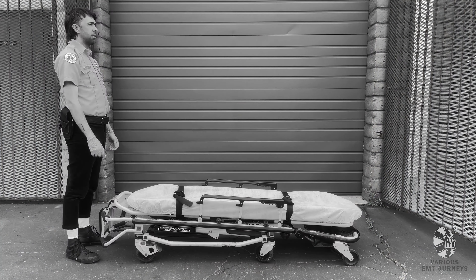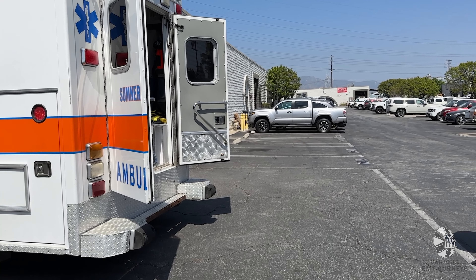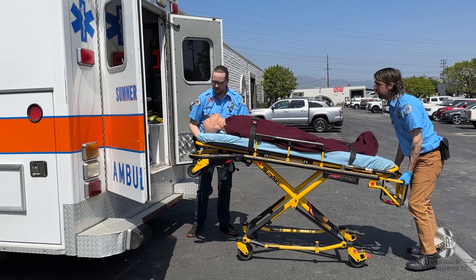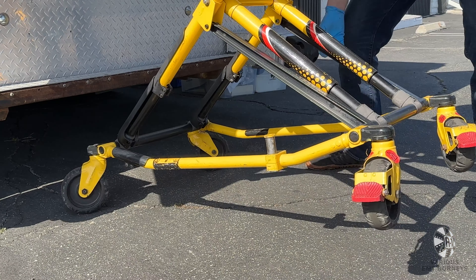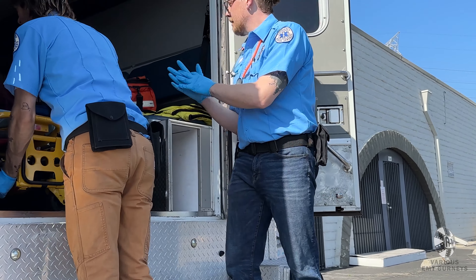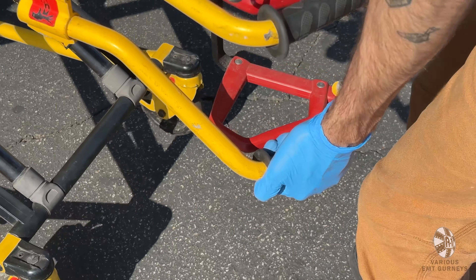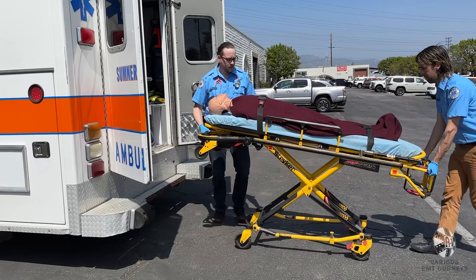Do not pull the lever if the folded gurney is fully tilted, or the undercarriage will fall suddenly. To load into an ambulance, push the head end towards the opening, making sure that the gurney is at its highest position. Push the loading wheels inside and have the person at the foot end lift and pull the release lever. The other person will lift the transport wheels and then help push the gurney into the ambulance. To unload, reverse this process. Hold the lever and have the second operator lower the undercarriage. Release the lever to lock the legs into place. Some ambulances have a safety catch, so make sure to raise the safety bar on the gurney before unloading.